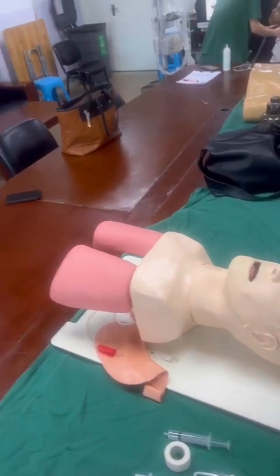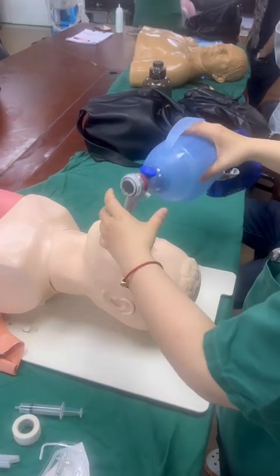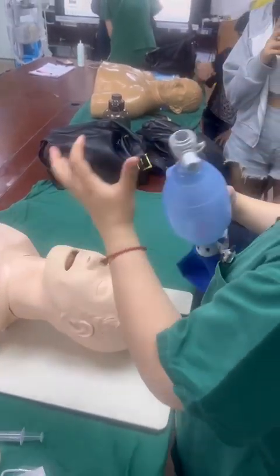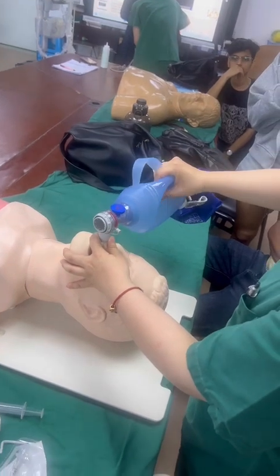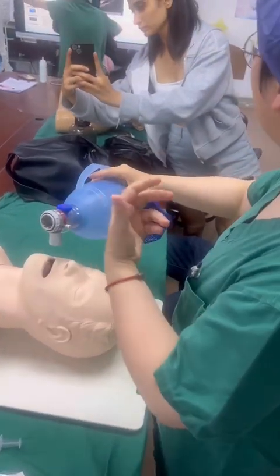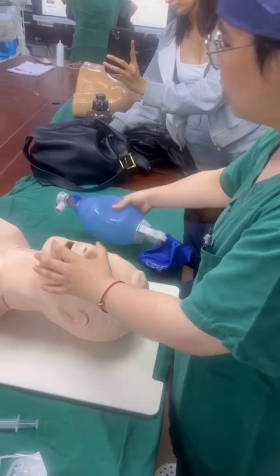Then we give the pure oxygen for the patients. We give the drugs, then we give the oxygen. Here, we can use our hand to lift the angle of mandible to give the oxygen. Three minutes after, we can do a tracheal intubation.